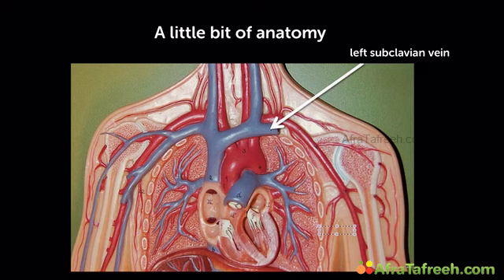Look here, this is the aortic arch, right? And the subclavian vein is right on top of the aortic arch. And since this patient had an aneurysm of the aortic arch, there's some form of compression of this subclavian vein. And if you inject the contrast, obviously, into the left arm, then you will see increased flow or kind of turbulent flow where the obstruction of the subclavian vein is.